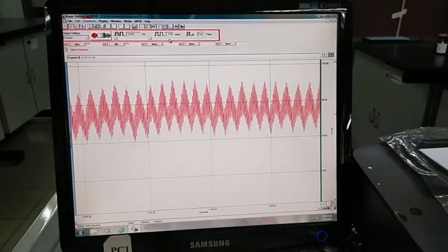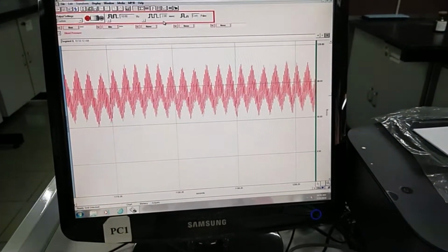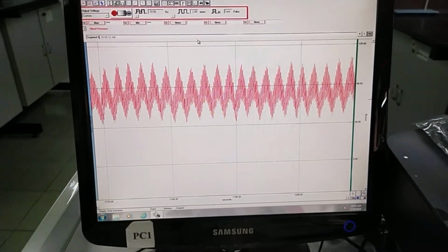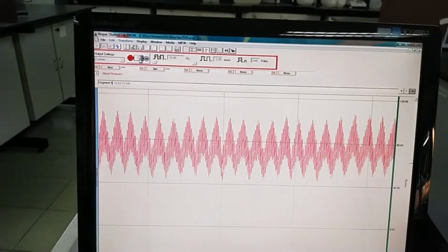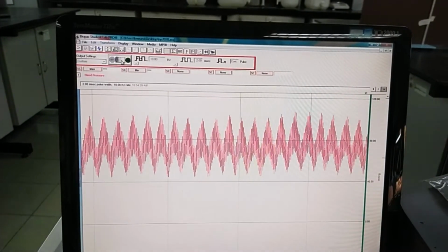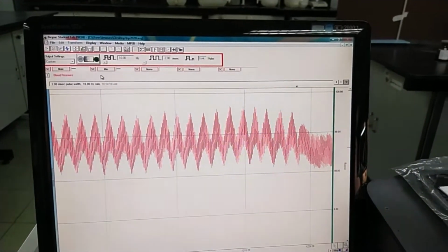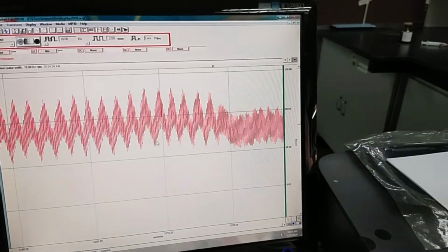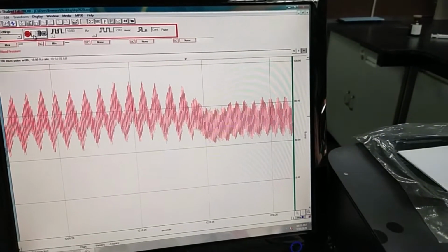When we place the electrode underneath the nerve and after we're ready, then we can click start to stimulate the nerve for 10 seconds. We have the on and off button here, so we can click it and stimulate the nerve for 10 seconds. So, 1, 2, 3. What we want to observe is the effect of the electrical stimulation on the blood pressure. You can see that the blood pressure becomes a little bit lower than the original blood pressure.